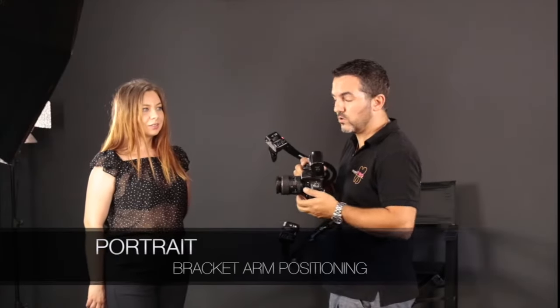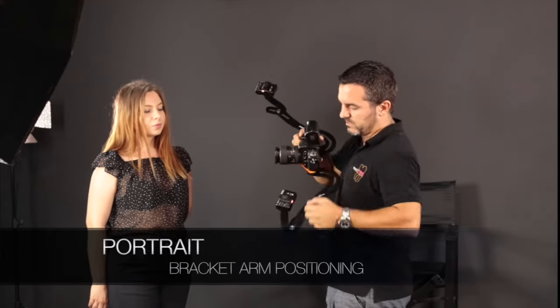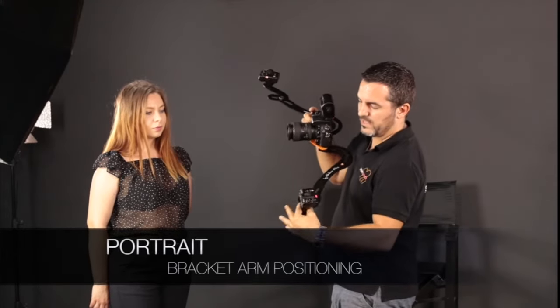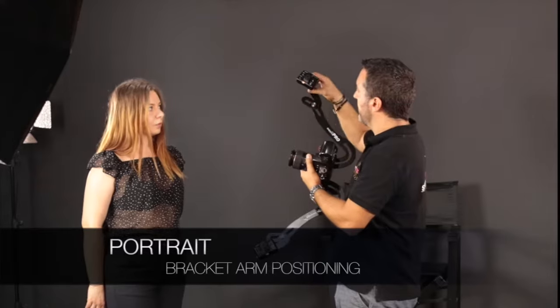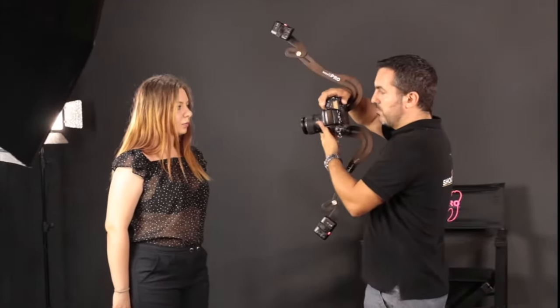Now, if you want to shoot portraits, all you have to do is just extend the arm to maximum, like this. And then place the lights towards the patient, of course. And then you are ready to shoot portraits.